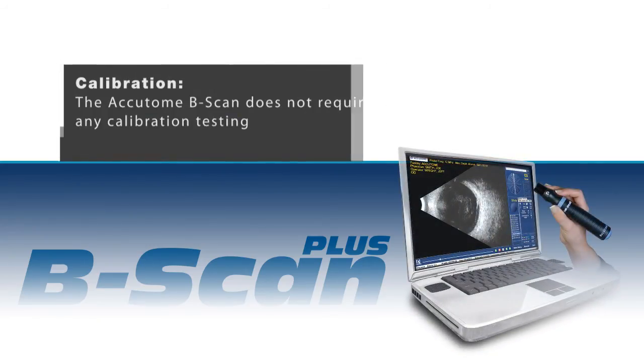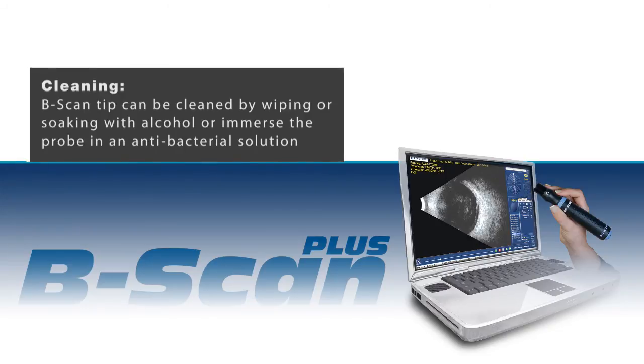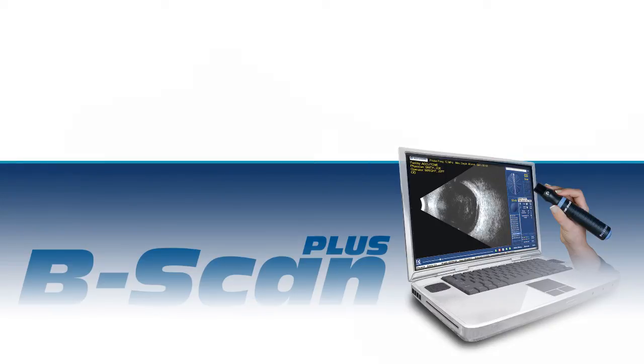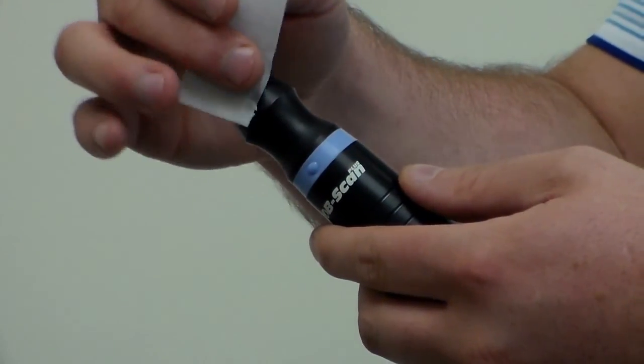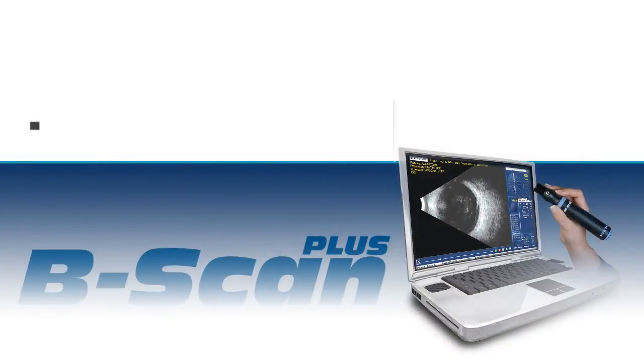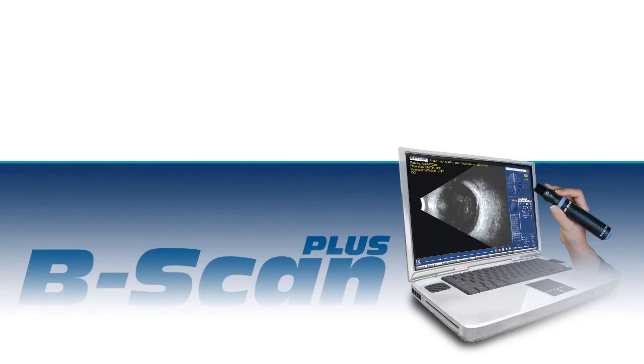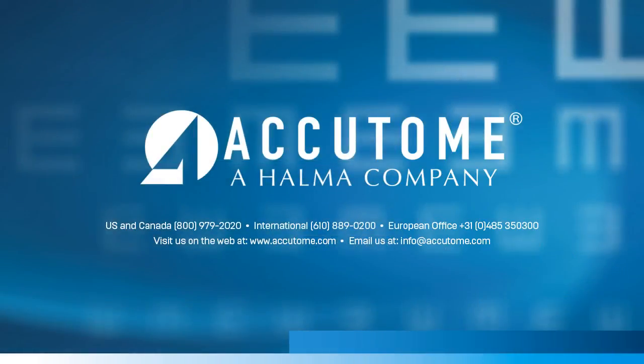The Accutome B-Scan does not require any calibration testing. You can clean the B-Scan by wiping or soaking the tip with alcohol, or if higher level disinfection is required, immersion of the probe tip in an antibacterial solution such as Cytex or Sporacetin is an acceptable infection control technique. Do not autoclave. Please feel free to contact your Accutome representative regarding any questions.